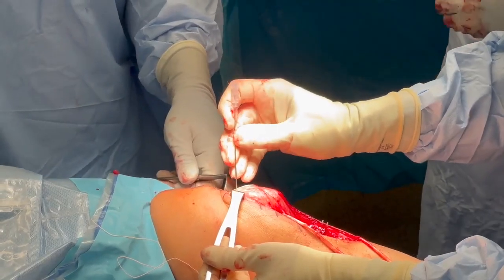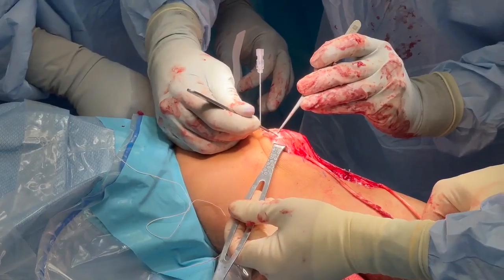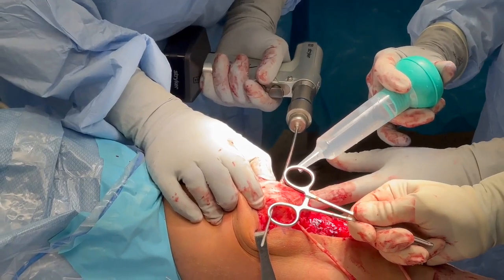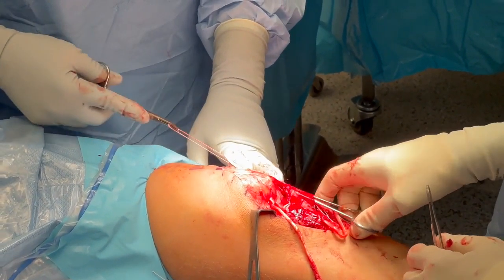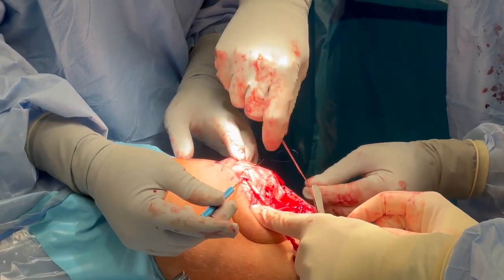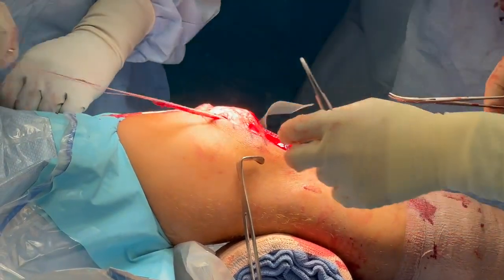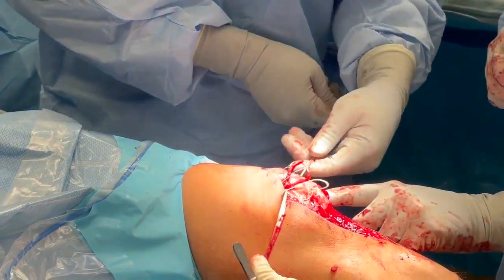A spinal needle was placed to mark the superior pole of the patella and the patella length was measured to find the midpoint. A dissection was carried down to the bone and a guide pin was drilled horizontally from lateral to medial across the patella at this point. This was over-reamed with a 4.5mm endobutton reamer. The grafts were then passed deep to the fascia along the medial and lateral edges of the patella up to the drilled patella tunnel. The gracilis graft was passed along the lateral edge of the patellar tendon from lateral to medial through the patella tunnel, and the semitendinosus graft was passed along the medial edge from medial to lateral, both using a Houston suture passer.